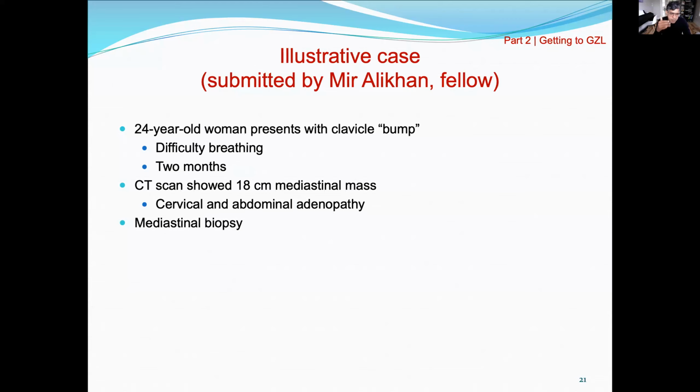So obviously, when I go for lymphoma workups, I try to make an a priori decision about what all things could be based on the location. Based on age and location, your first choice is probably going to be a Hodgkin. Classical Hodgkin is very likely. And of course, if you have a second choice to offer, you're going to think of maybe a T lymphoblastic process.